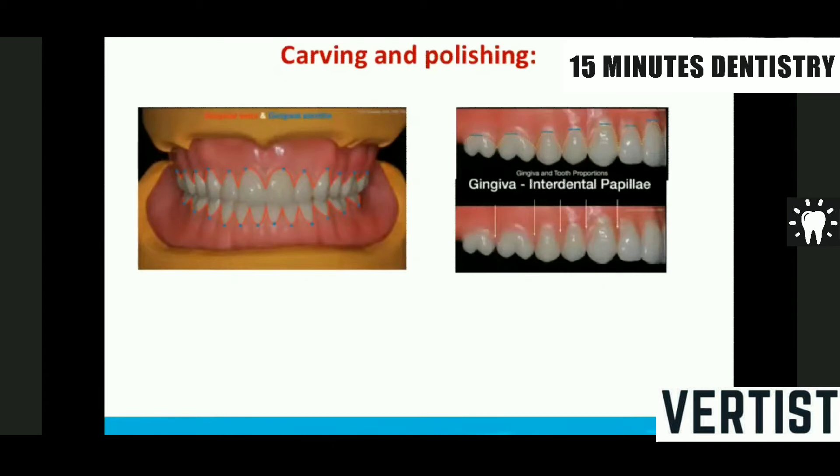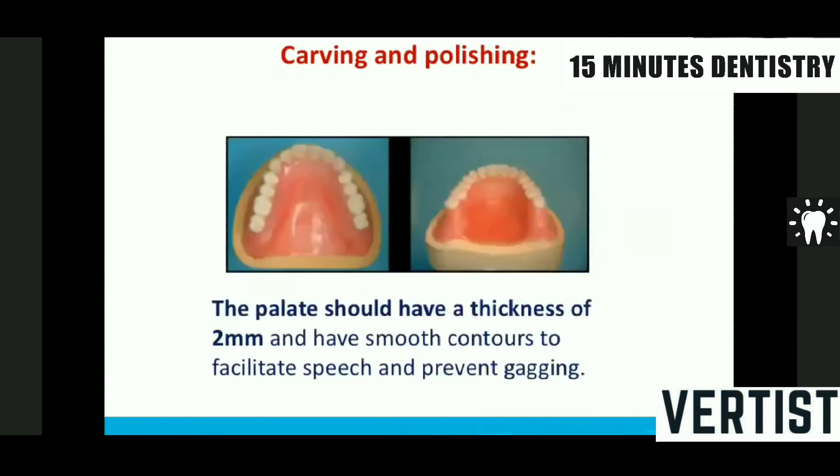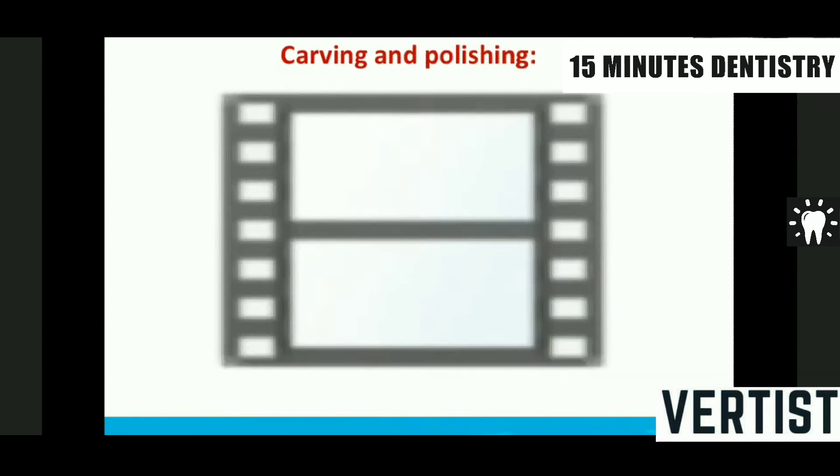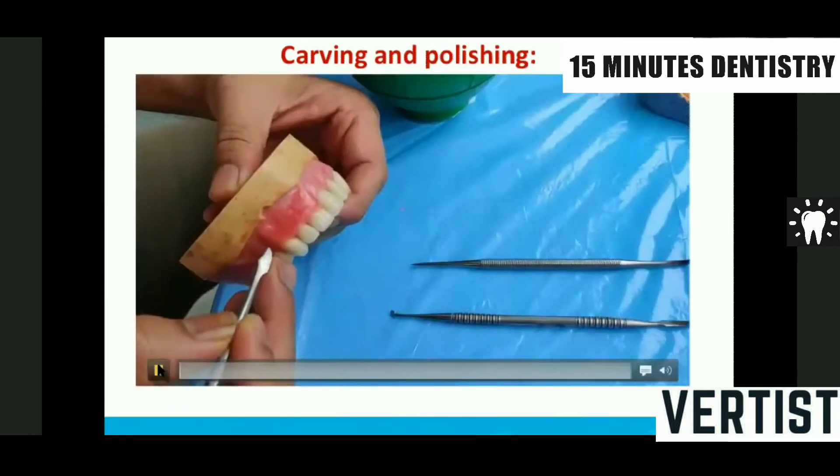In teeth arrangement we also have to try to establish this margin. When doing palatal polishing, the palatal thickness of the wax or temporary denture base should be at least 2 mm so that you can reduce it while polishing. This is an attempt to demonstrate carving with limited resources, as the colleges and clinics are closed.